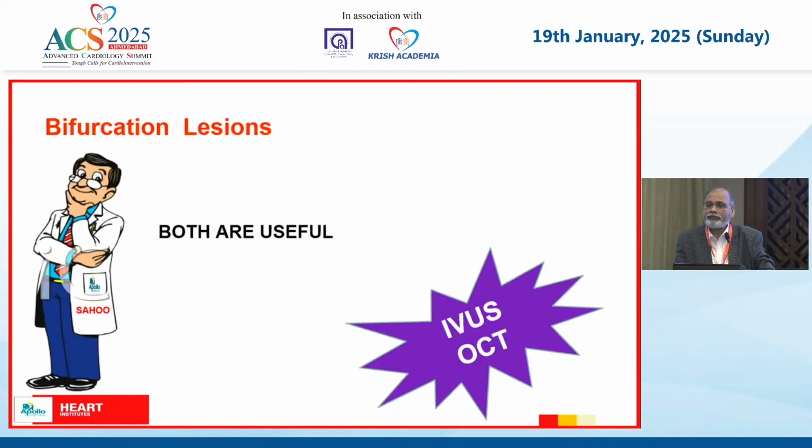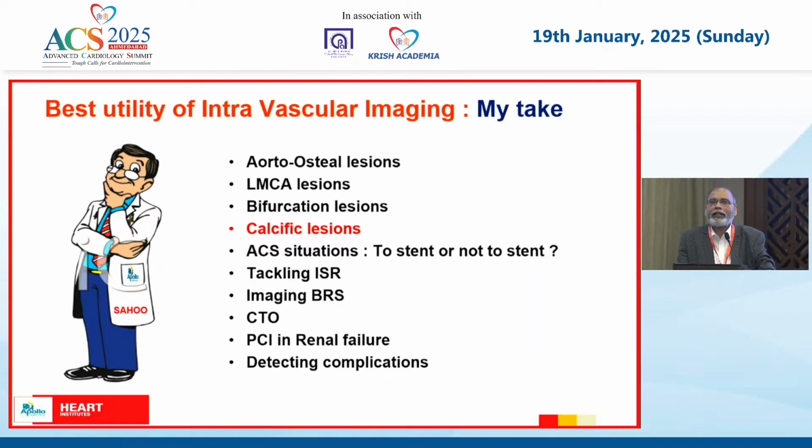Both are useful in bifurcation. Use what you have in your lab, IVUS or OCT. I have both, so it is my prerogative, and seeing the patient's pocket, I use what I have to. Now let us come to calcific lesions.